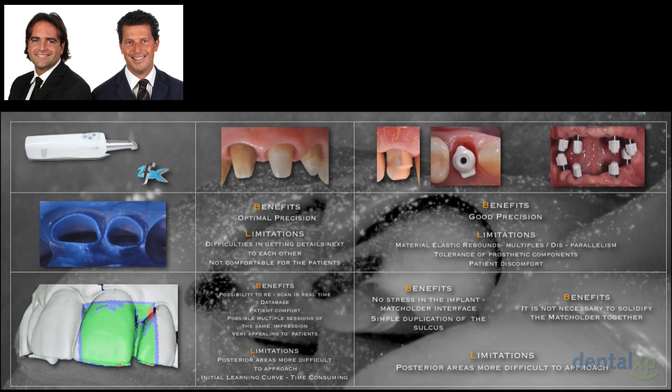Also, posterior areas are more difficult to approach, especially at the beginning if you're not used to the intraoral scanner. But every day we are increasing the potential of this instrument, and I think this is the future. This is the future, but it is already the present, because in these two webinars you could see that there are a lot of things that can already be done with the help of the new technologies.